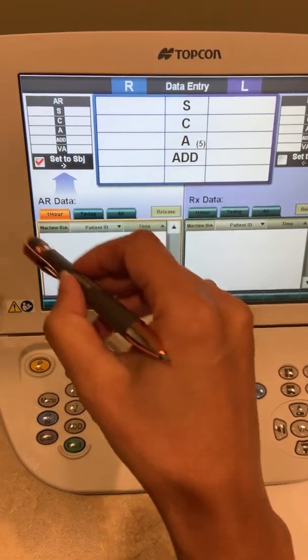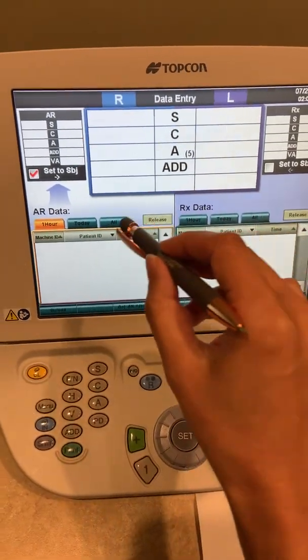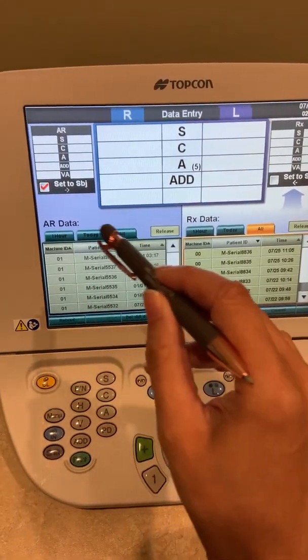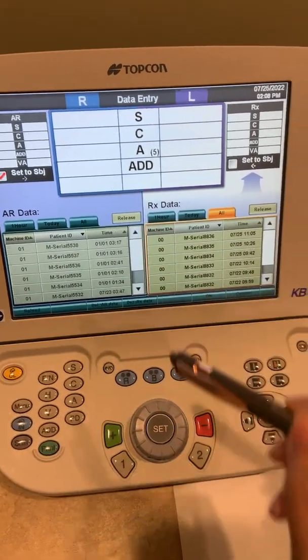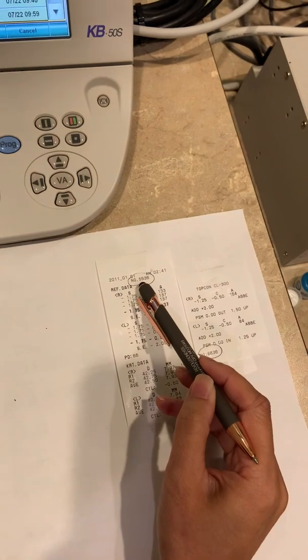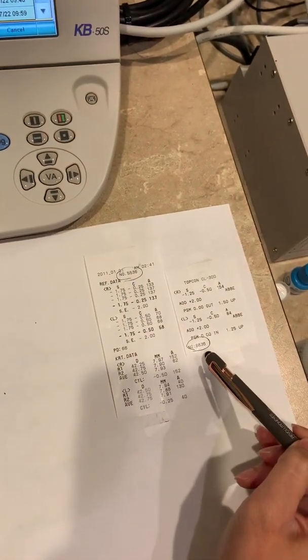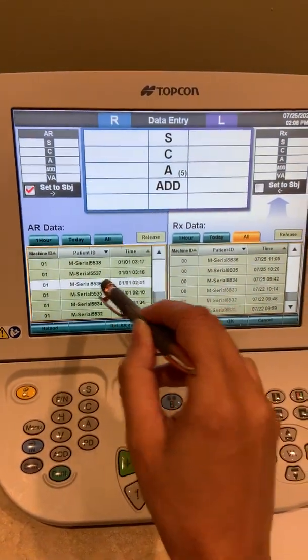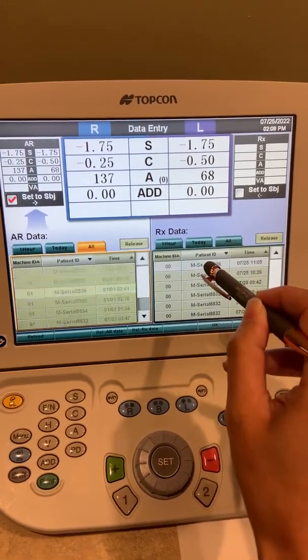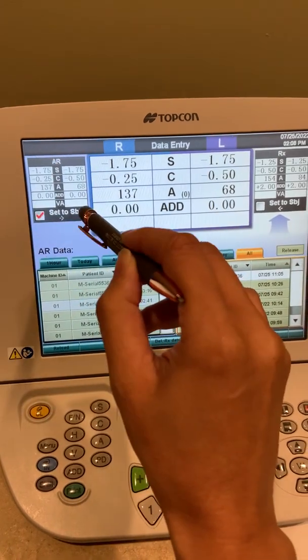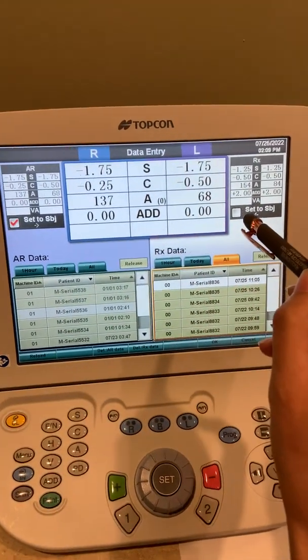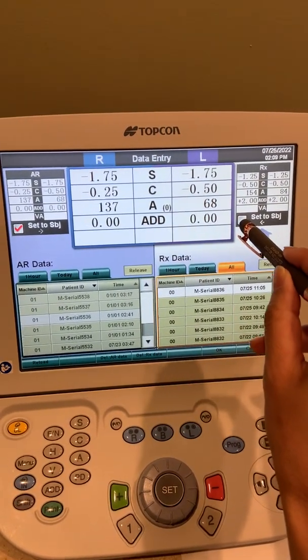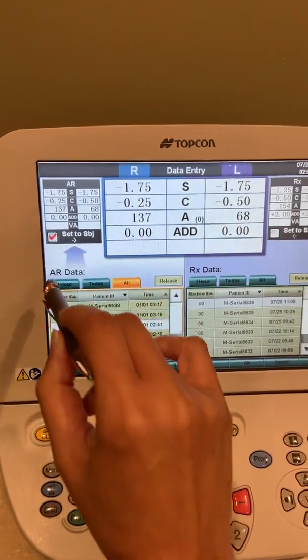It will bring you to the screen where we have our autorefractive data and our lensometer data. If you press all, all of the information will appear. The patient ID is located here and here, which will correlate to the autorefractor and the lensometer readings that our OD tech has gotten for you. I'm going to go ahead and input the information, and what you'll see is that it will default to our autorefractor into the phoropter. You can change it to the lensometer reading if you prefer and hit set to subjective here, but remember it will default to our autorefractor.